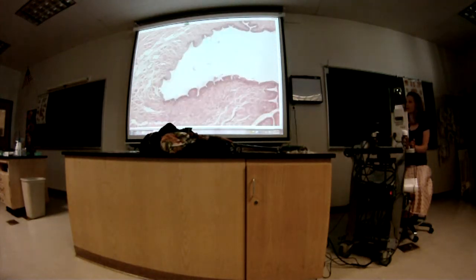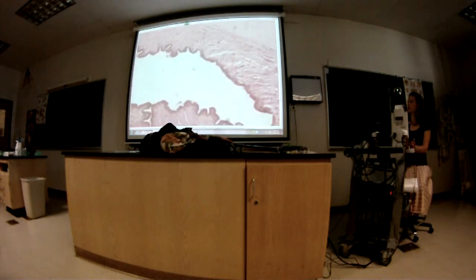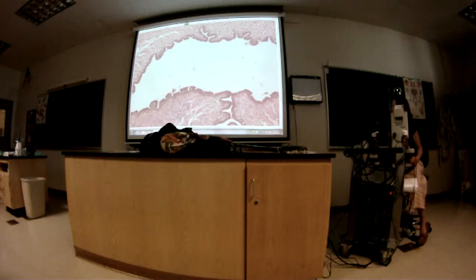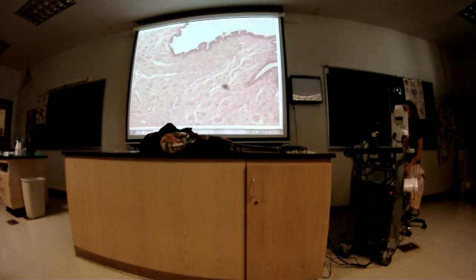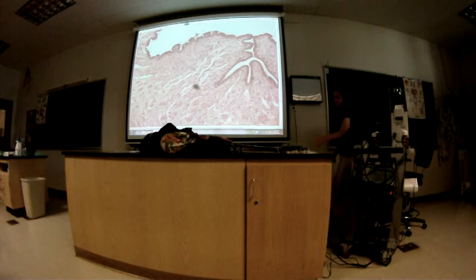See if you recognize that opening. Tell your neighbor what that opening or passageway is. The spongy urethra. Yeah, that's the spongy urethra. Okay, and how about this tissue mass? The corpus spongiosum. Yeah, that's the corpus spongiosum.